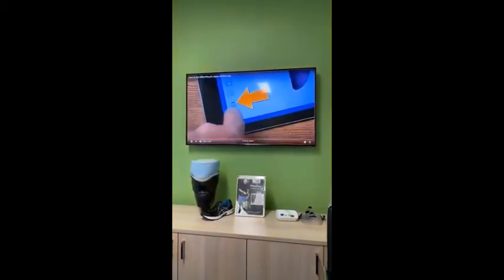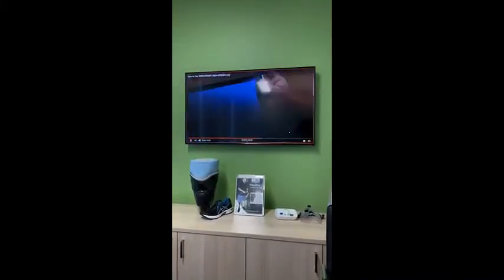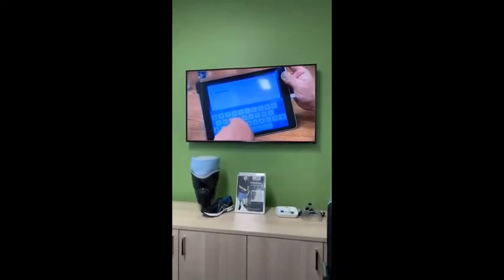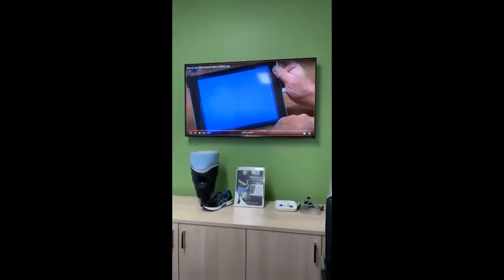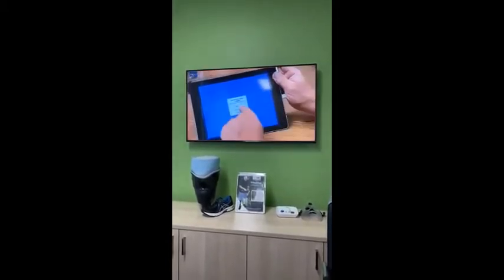Finally, let's tap this Scan Notes icon, which lets us type some details about how we should make this liner. Tell us what you want the base thickness of the gel to be, and tell us the areas where you want thicker or thinner gel. For example, as we see here, you might want a base gel thickness of 7 millimeters with a distal pad that is 12 millimeters thick. This is where you can communicate all of that to us. When you're done typing, exit the screen to go back to the model screen.